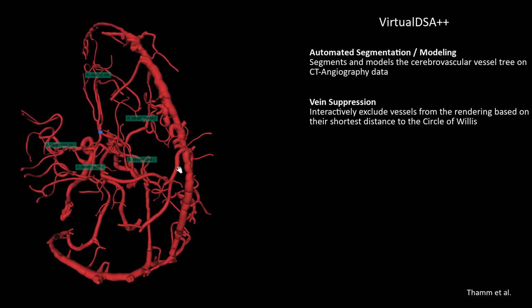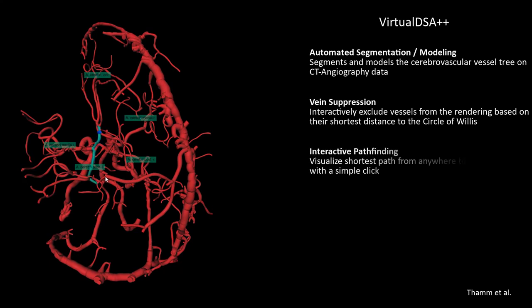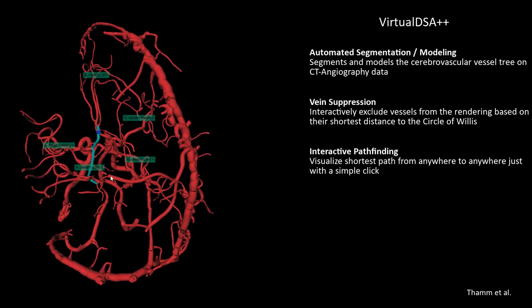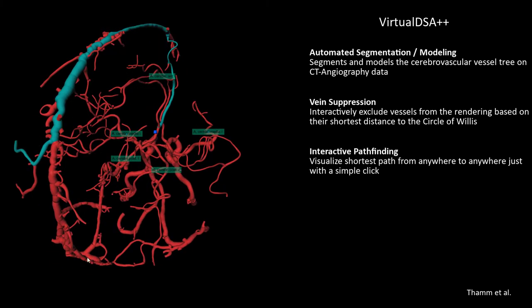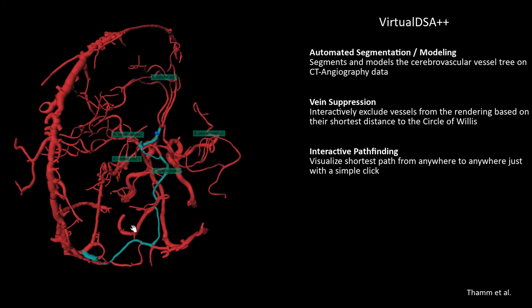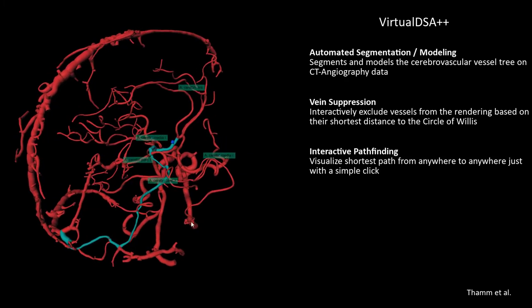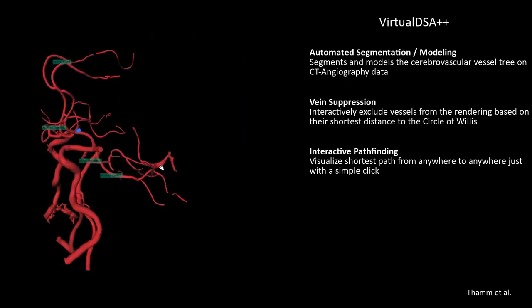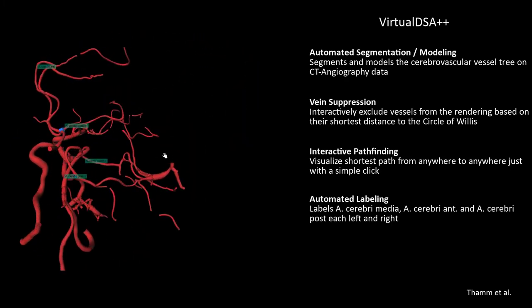VirtualDSA++ also allows to interactively search for shortest pathways just by clicking into the desired point. This feature is meant to be used to plan mechanical thrombectomies, for instance.